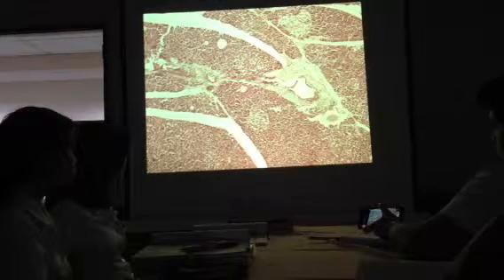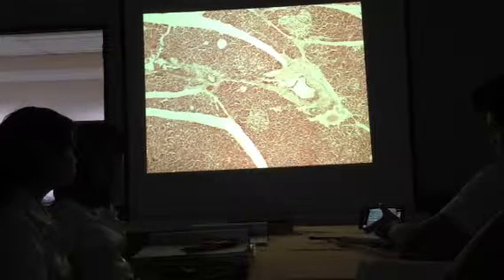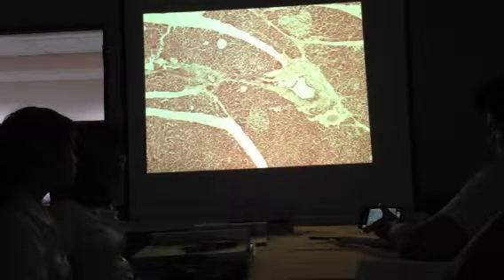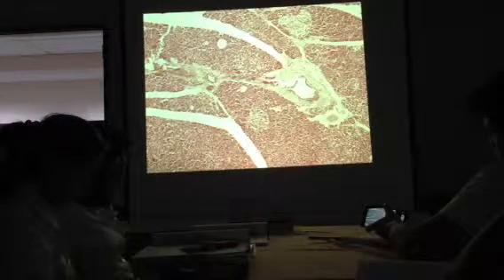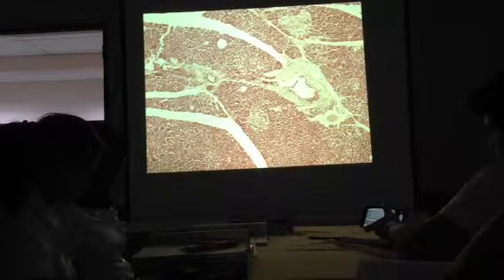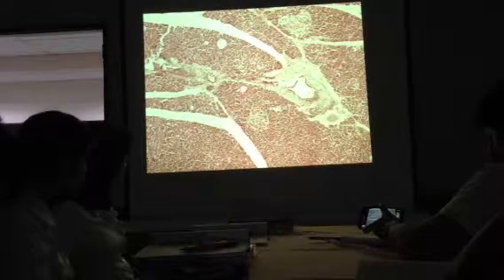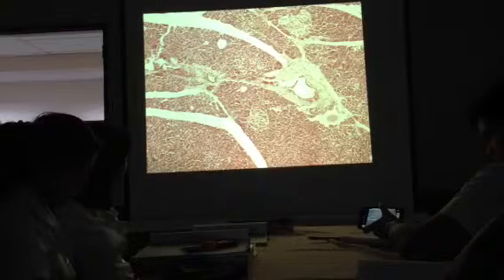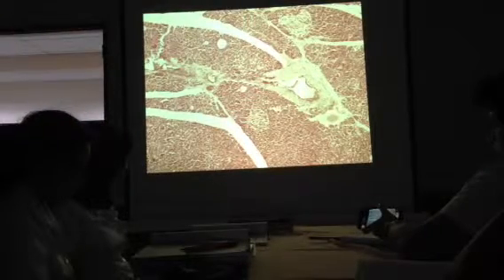Okay, so we have just studied the exocrine portion. The secretory portion is what type of acinus? Serous, which are grouped into lobules. Inside a lobule, a duct is called intra. Outside of the lobule, inter. That is the endocrine portion.